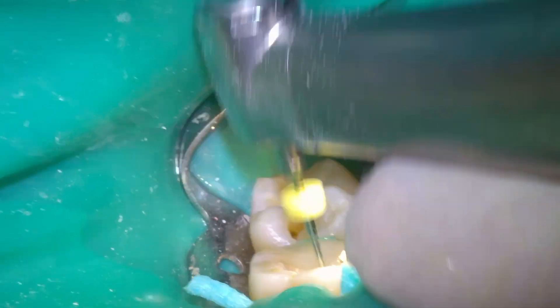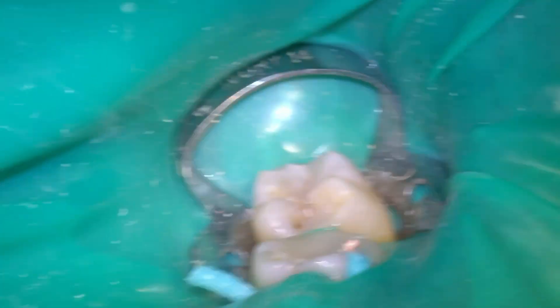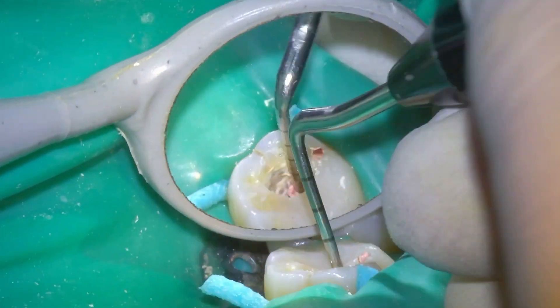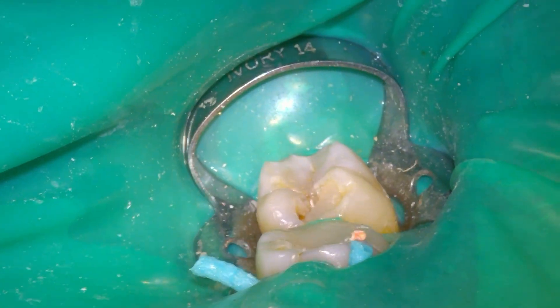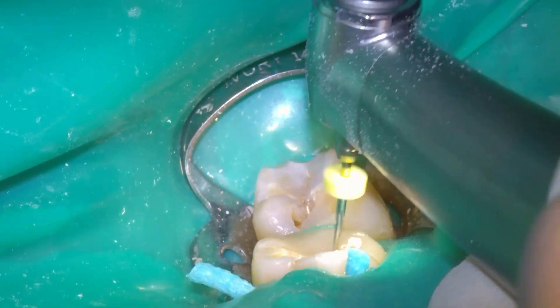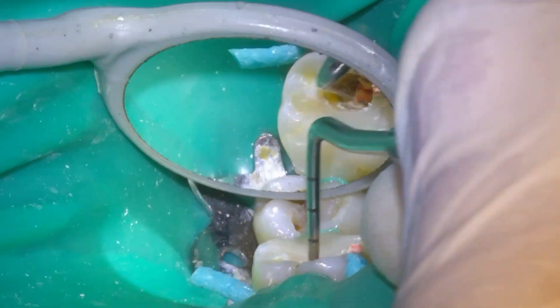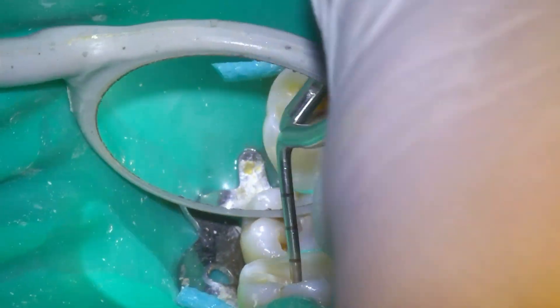To perform the technique correctly, the contra-angle must rotate clockwise, otherwise the root could fracture. The rotation speed should be approximately 10,000 rpm, and the thermocompactor should be two or three sizes larger than the final master file.